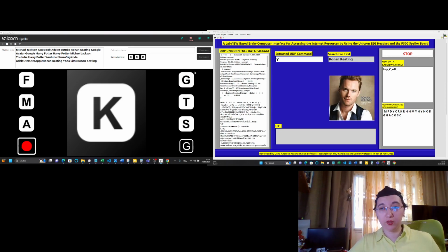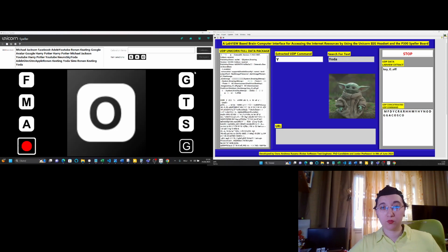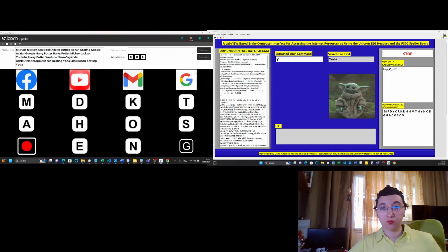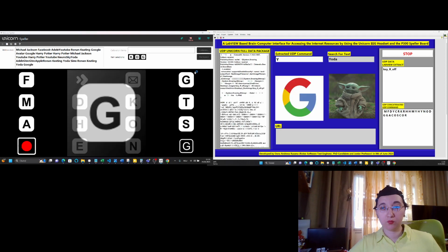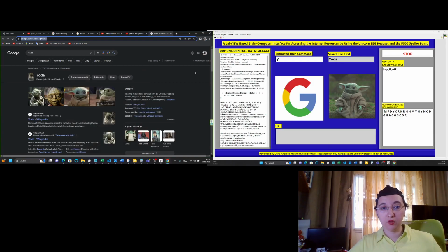Okay. Again, Yoda and Google. Okay. And now Google. Okay. So it's the result that I expected. Yoda is searched in Google. You see the related content.